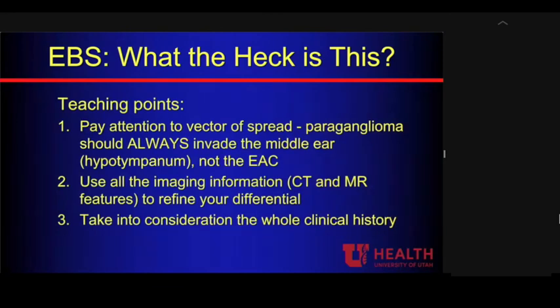So teaching points: pay attention to the vector of spread. Paraganglioma should always invade the middle ear, not the EAC. Use all of your imaging information to refine your differential and take into consideration the entire clinical history.